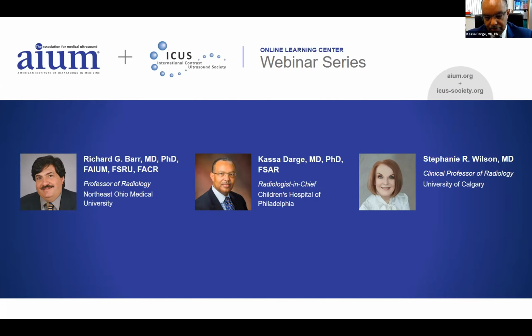Yeah. Now, a question that I think is an important one is, what have we experienced in terms of patient side effects? Certainly none of us spoke about this today because I asked all of the presenters to talk a little bit outside the box, about things that you're not going to have just learned in all kinds of previous educational programs. But safety of the contrast agents is indisputably a great component of doing CEUS.